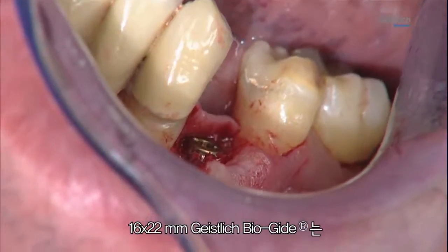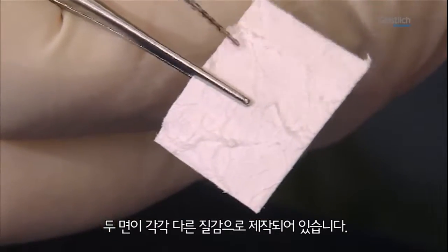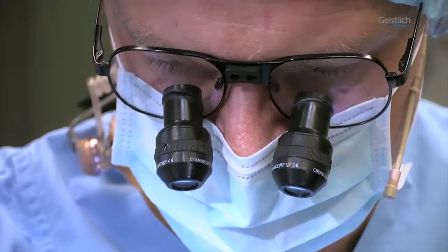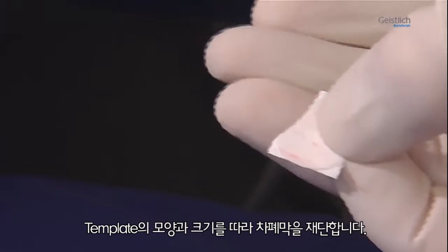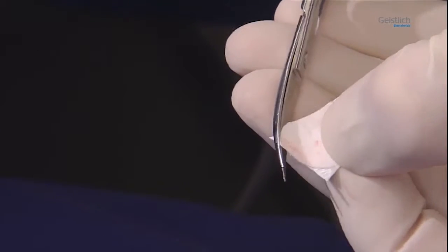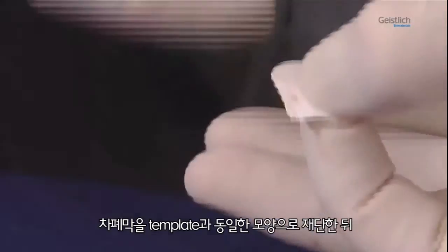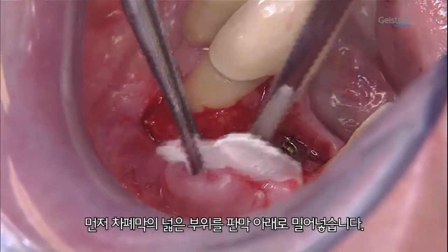The 16 x 22 mm Geistlich Bio-Gide has two differently textured sides. The outside of the membrane is marked with the embossed word "up." The shape and dimension of the template are now transferred to the membrane. The embossed "up" can be clearly seen here again. Once the membrane has been cut to match the template, its broader base is first pushed under the mucoperiosteal flap.